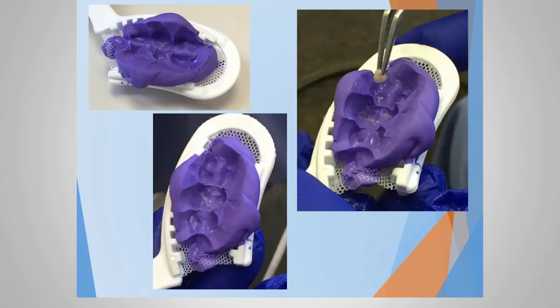With these buccal margins, again, I go back with my finishing burr to make them more defined. Since they washed out here, I want to make them more defined here. And once I did that, also removing the interproximal materials so that I have good intimate contact both distally and mesially for my temporary. Once I did all that, I'm going to rinse off this matrix, go back in with a cotton pellet so that I'm reassured that all the residue from that temp matrix is gone and it's not incorporated in my temporary that I'm going to be making within this matrix.